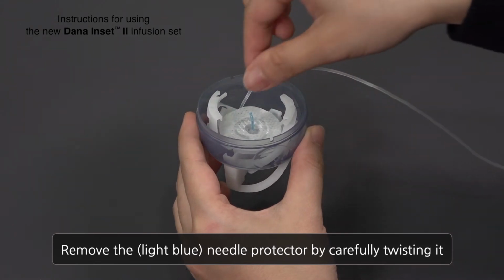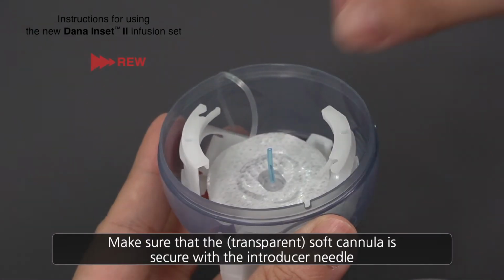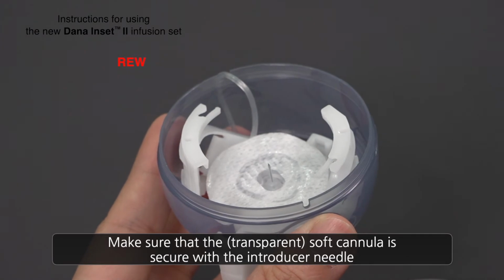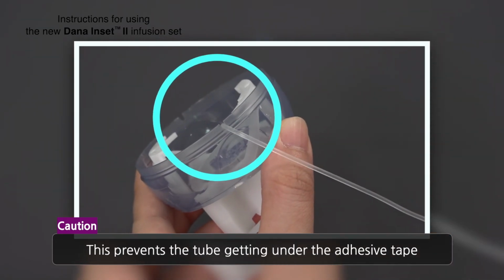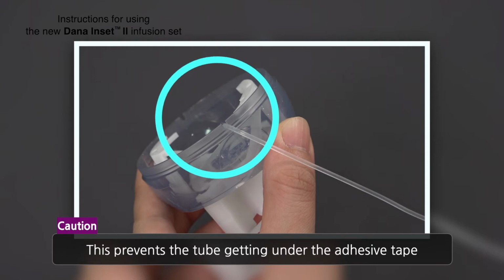Remove the light blue needle protector by carefully twisting it. Make sure that the transparent soft cannula is safe and securely attached with the introducer needle. Caution: prior to placing the insertion device onto the disinfected skin, the tube should be placed into the small groove. This prevents the tube getting under the adhesive tape.